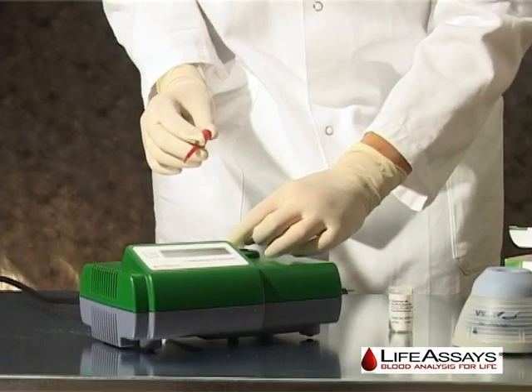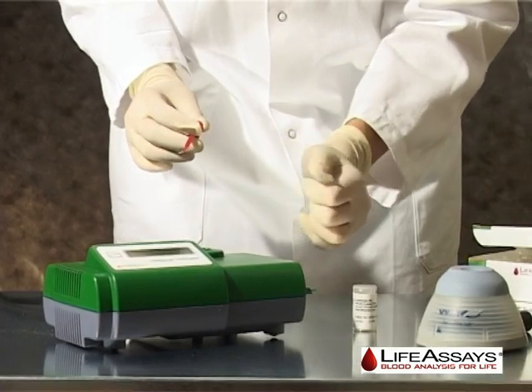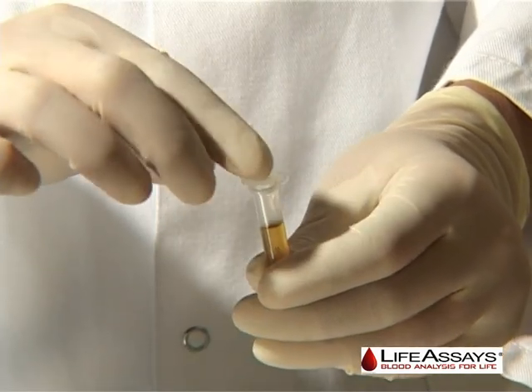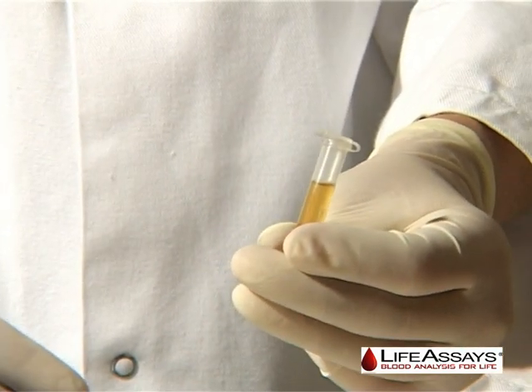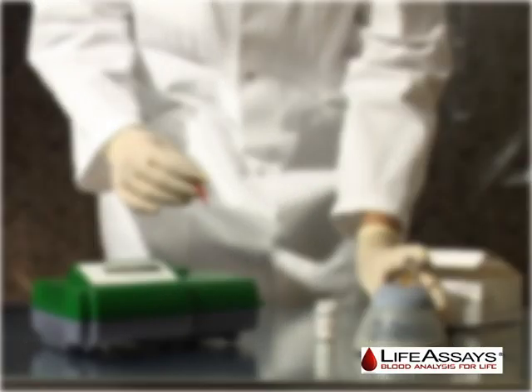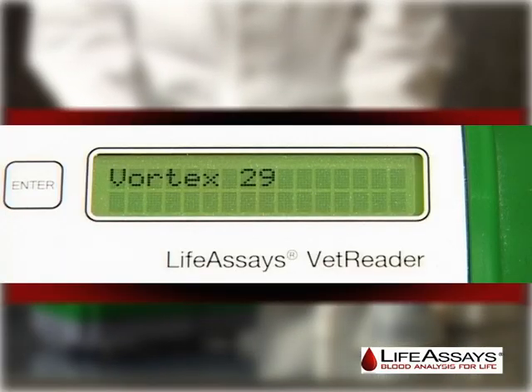Unload the reagent vial from the VetReader. The user now has 5 seconds to open the capillary, drop the capillary into the reagent vial, and close the cap. The display will automatically switch to vortexing mode showing vortex 30.